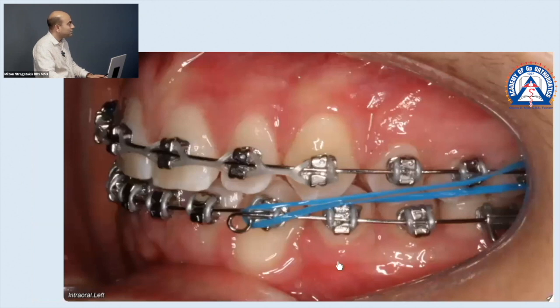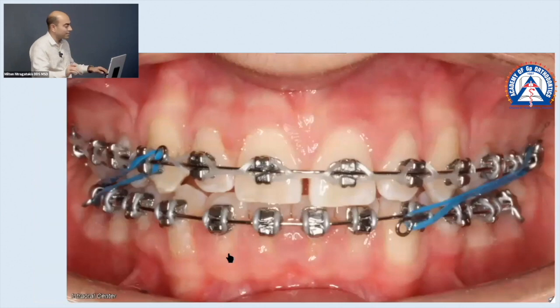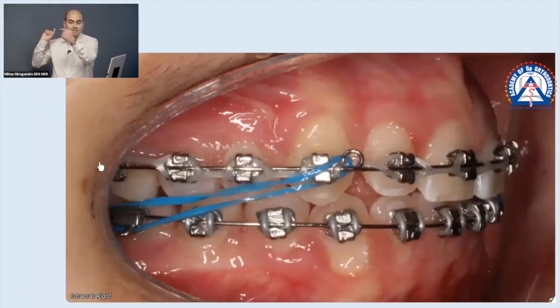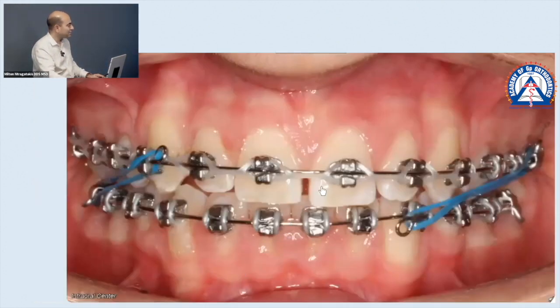Okay? And now let's look at our power chain. Watch this. It stops at the left 3. Why does it stop at the left 3? Because we have such minimal overjet, we don't want to close the space back, but because we want to favor the midline to go which way? The upper needs to go to the right. We extended the right all the way to the 6. So this is a 6-3 to put more force for the space to close towards the right. So that 6 is going to hold the midline where it is as the left incisor comes closer to the right. Does that make sense?